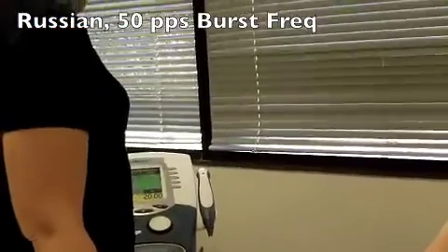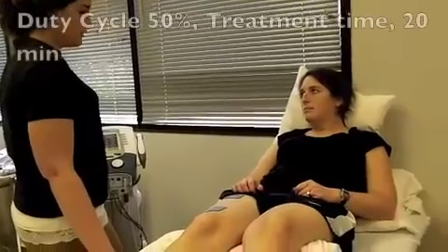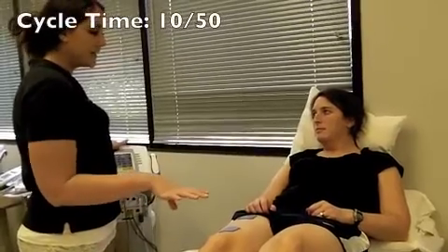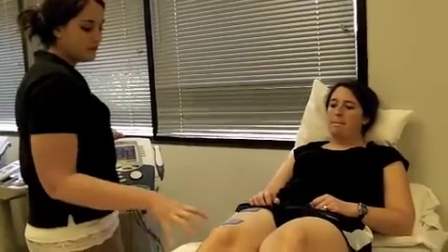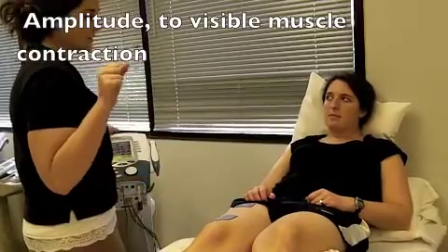Our settings for Russian are going to be: we're going to keep it at 50 for the frequency, and our duty cycle is going to stay at 50% right now. It's going to have a cycle time of 10 seconds on and 50 seconds off. The on time is when your muscle is going to be contracting. When you feel your muscle contraction, when you feel it come through here, you're going to go with the contraction.